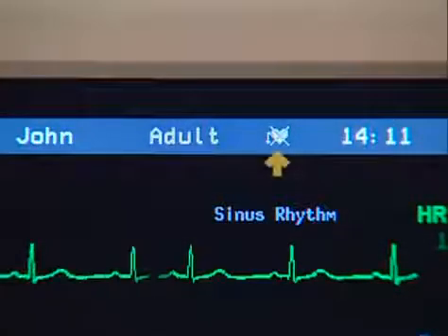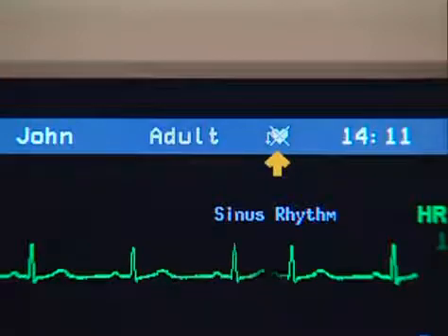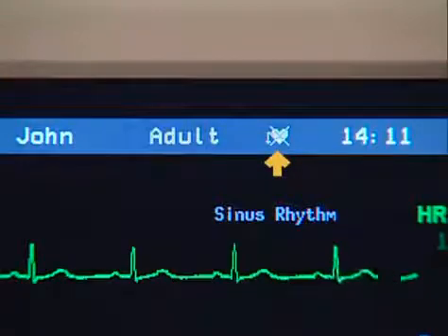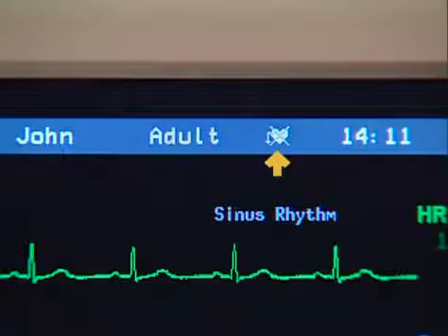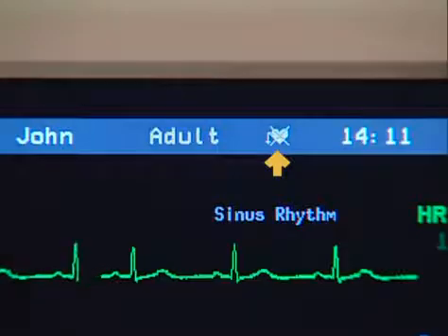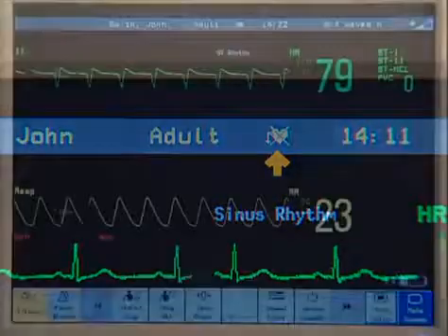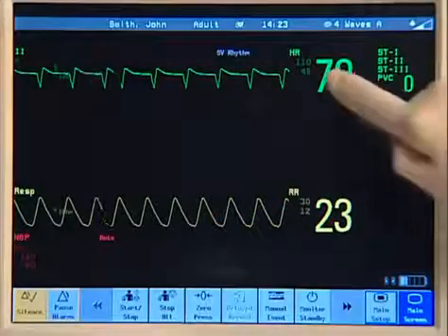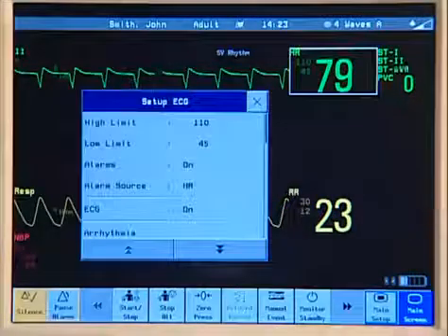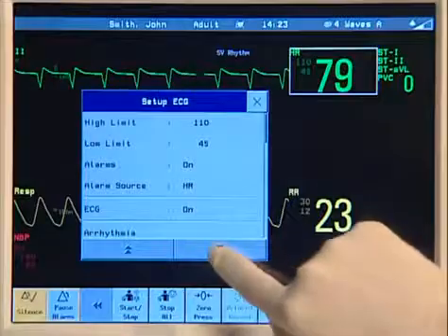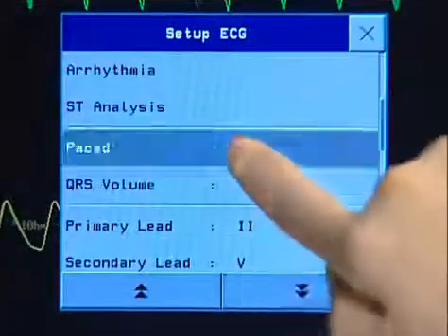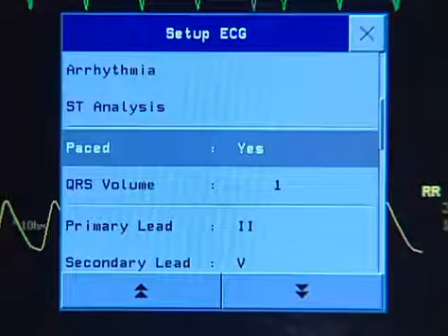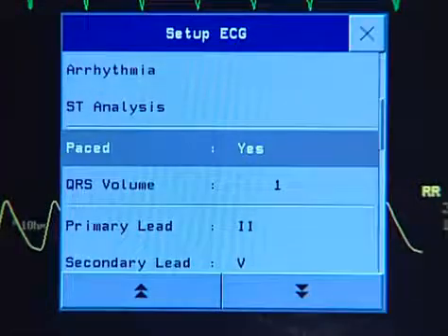This label indicates the patient is in non-paced mode, which is the default setting and the setting for a patient without a pacemaker. When you monitor a patient with a pacemaker, you must choose paced mode. Never use the non-paced mode for paced patients.